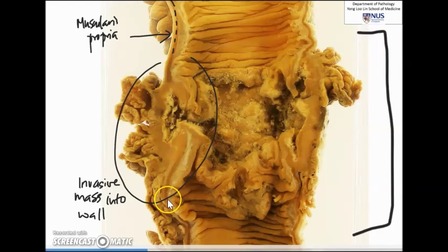The same thing you can see here, the muscularis propria is continuous here and then here it stops short because there is invasion of the tumor right through it.